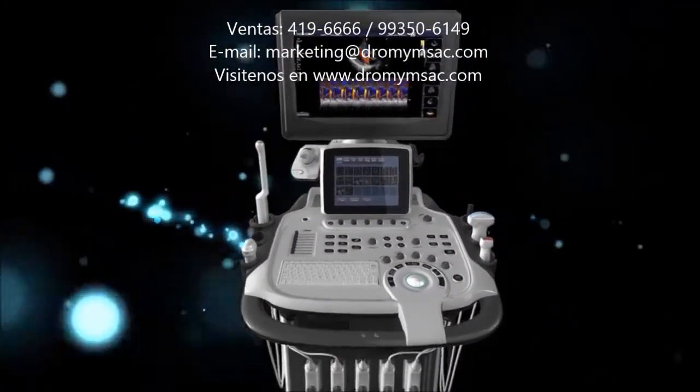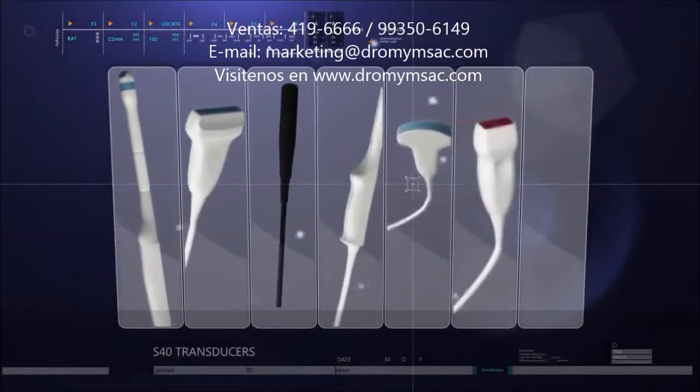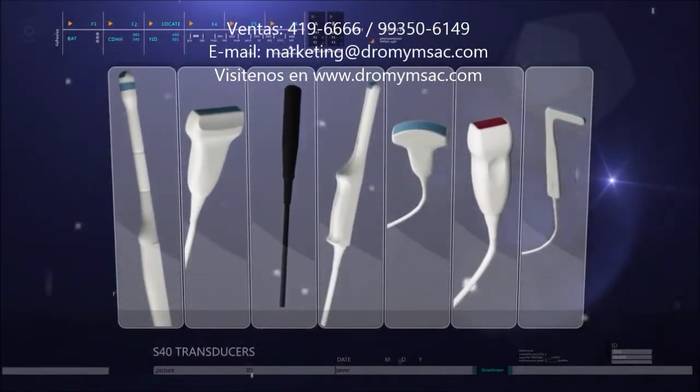S40, as with all Sonoscape products, has not only an excellent ergonomic design, but also cares a lot about image quality. S40 is available for all series Sonoscape transducers, easy for handling.